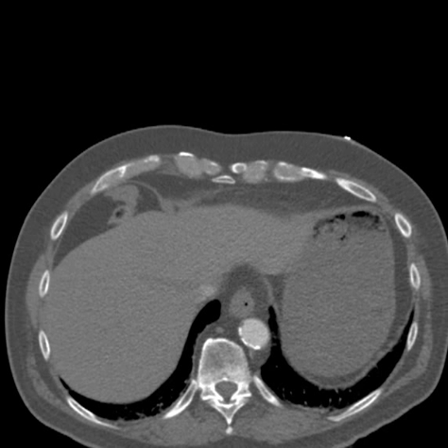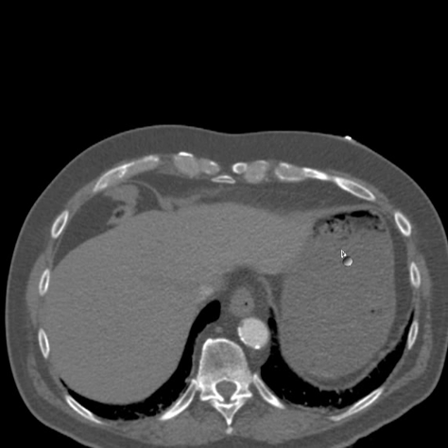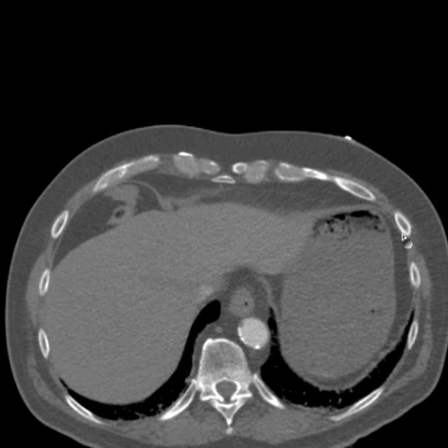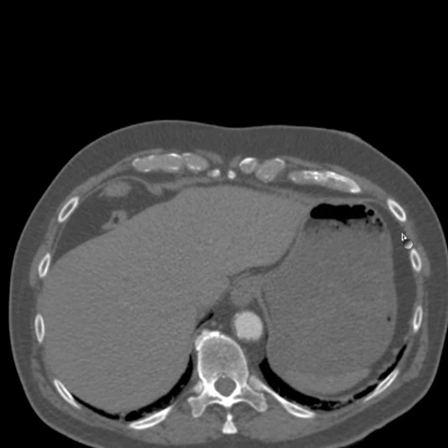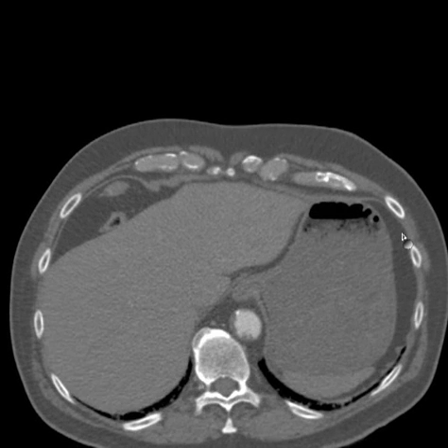Hello there, friends. This is Dr. Mintz. Here is a case of a relatively elderly individual who presented with severe abdominal pain and hypotension.